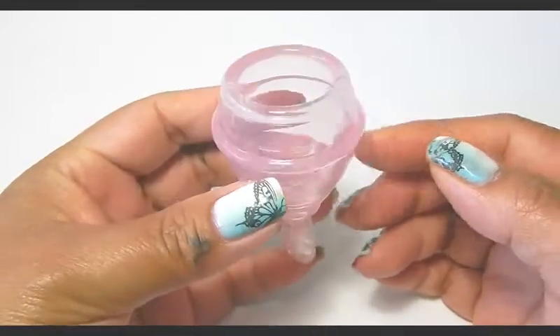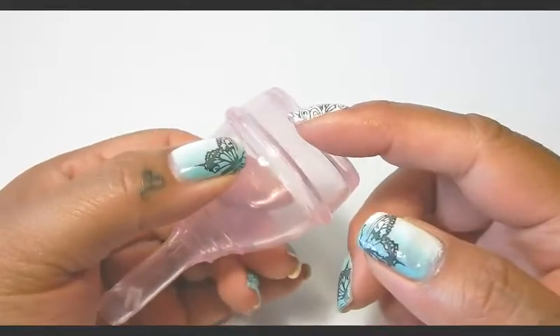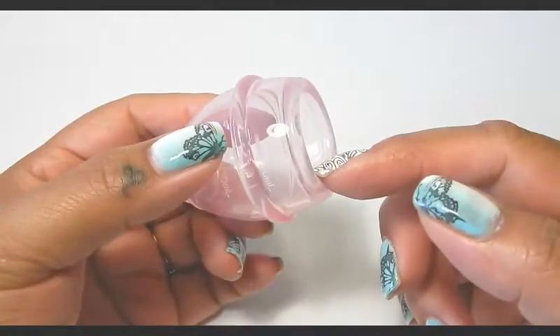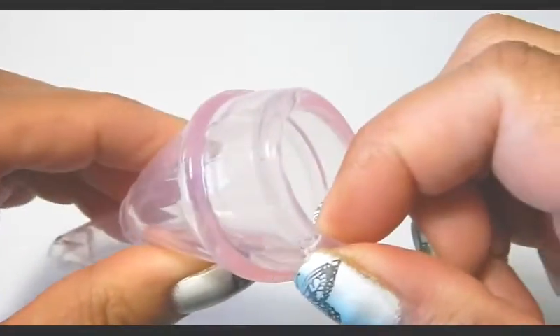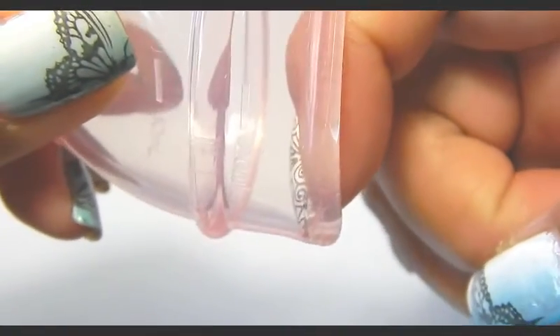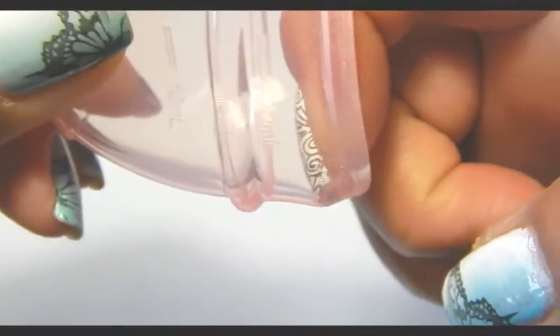I was talking to one of my Facebook buddies and she asked about the rim up on top if it was invisible, and at first I didn't even notice, but there is a rim on the inside of this cup. I'm just going to insert my finger and kind of pull it back and you can see that my nail is getting stopped right there or hooked.